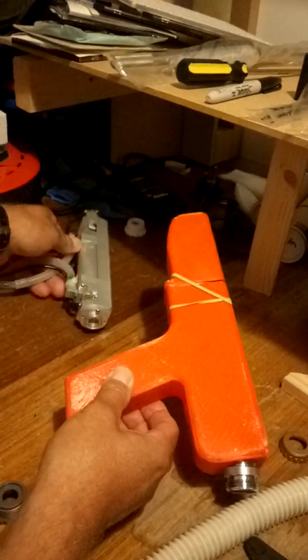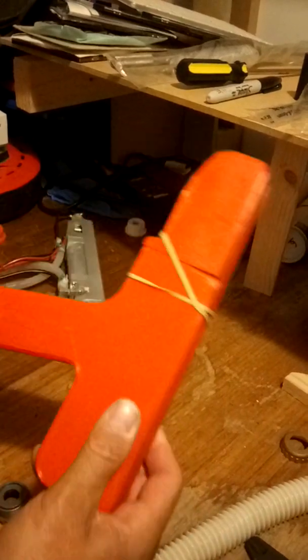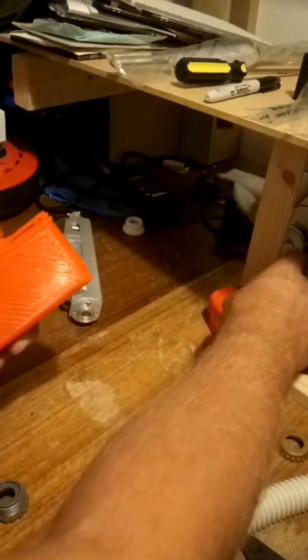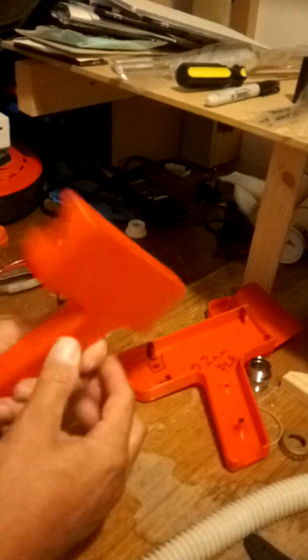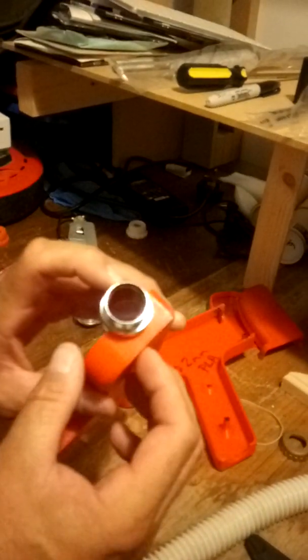So what I'm going to do is take a bit apart to show you the little problems I've come across, which are opportunities to solve. Okay, so before I send these away to be made correctly, this is just a prototype. As you can see, we're going to look at the front section. This is where that was sitting in there earlier, can you remember? Like that. Okay, and that's the front of the gun.